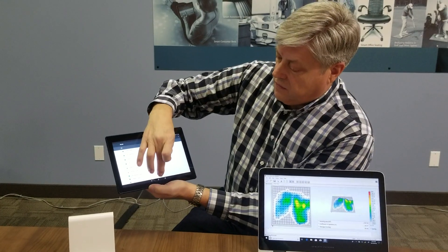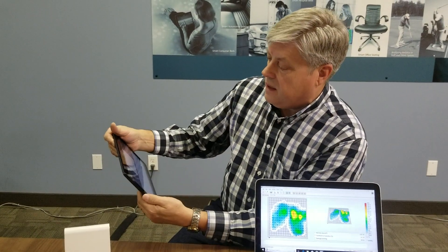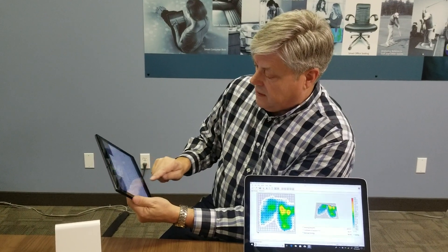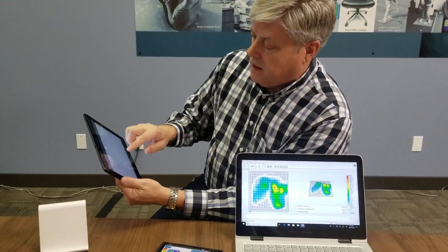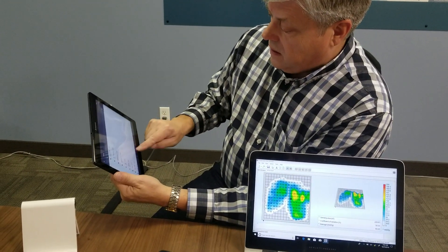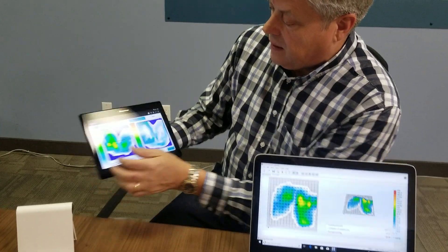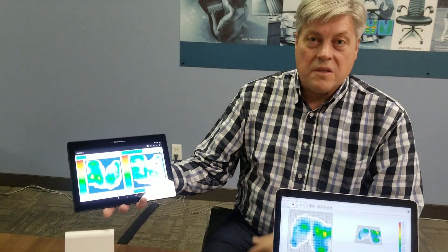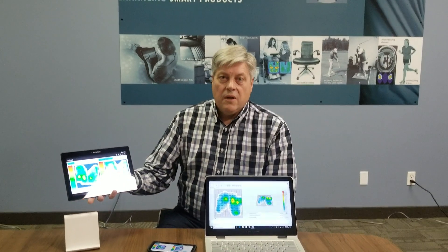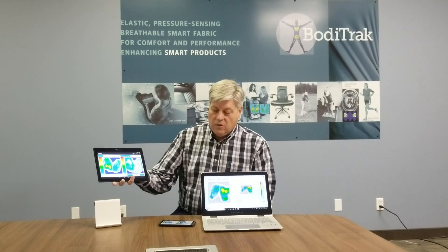I can go back to the software. I'll pick the spot, it's connected. I go back to my BodyTrack Lite software, and there we are. It's that simple to set up — literally within seconds, you're up and functional with the system in BodyTrack Lite or in the notebook mode.